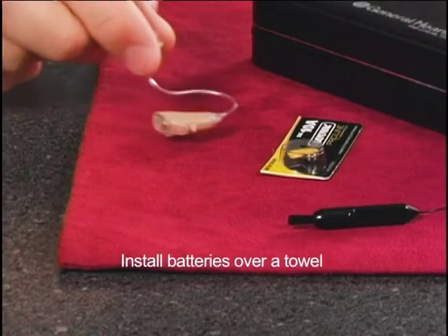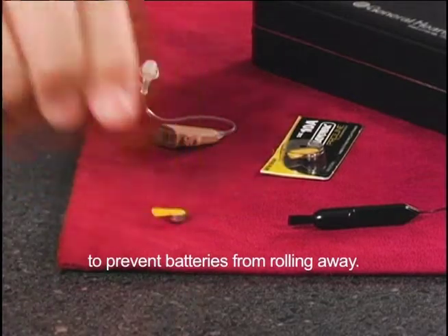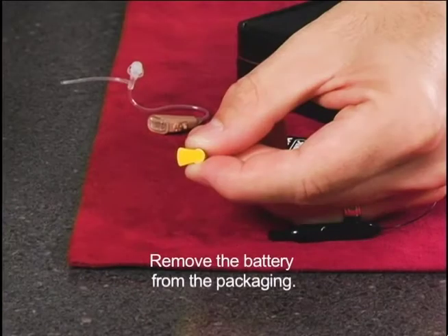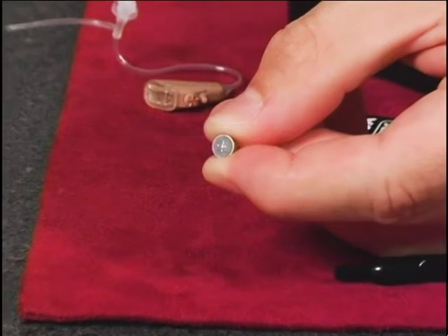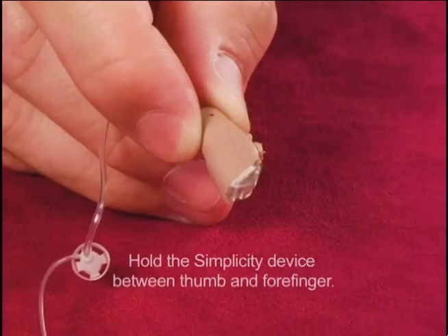We recommend that whenever you install a new battery to do so over a towel. This prevents the battery from rolling away should you accidentally drop it. Remove the battery from its packaging and peel off the paper activation tab. Notice that the flat side of the battery has a plus sign stamped on it.